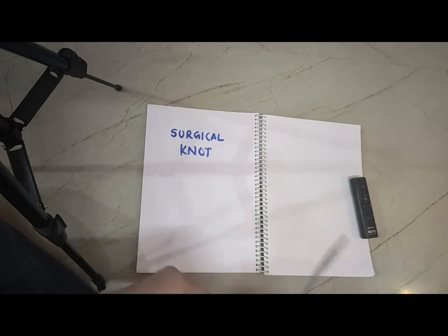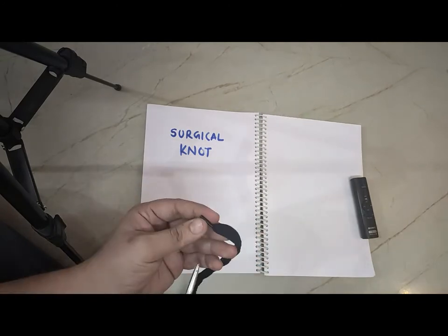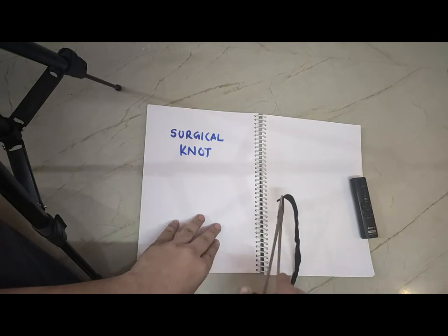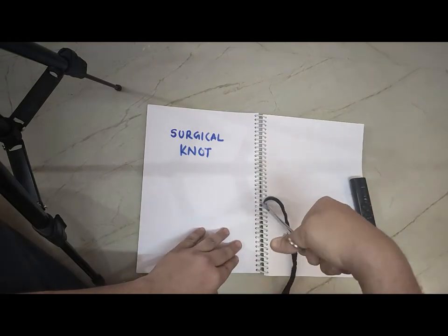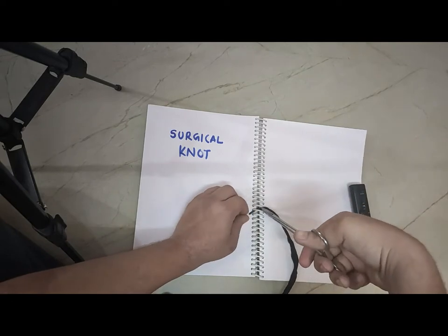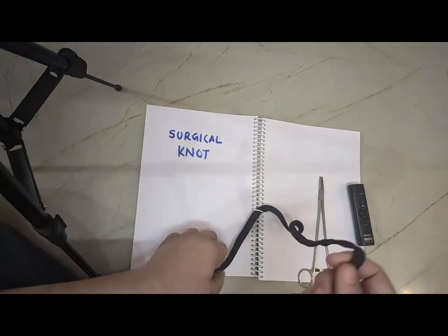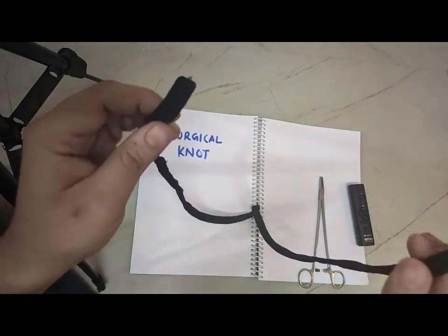Now, suppose this is our tissue and this is the needle holder. This is my needle and I am going to take a suture here. I have done it. Now I have taken the suture and I have to tie a knot.